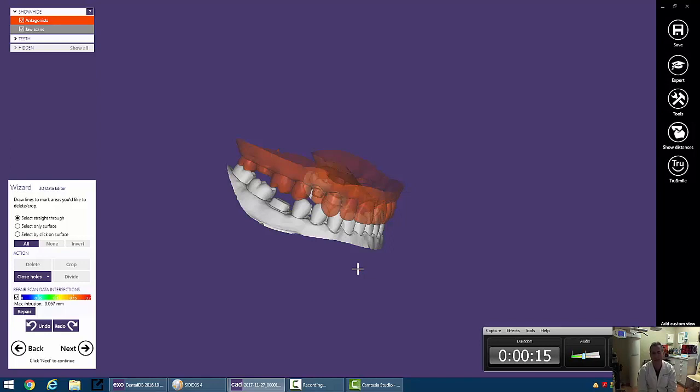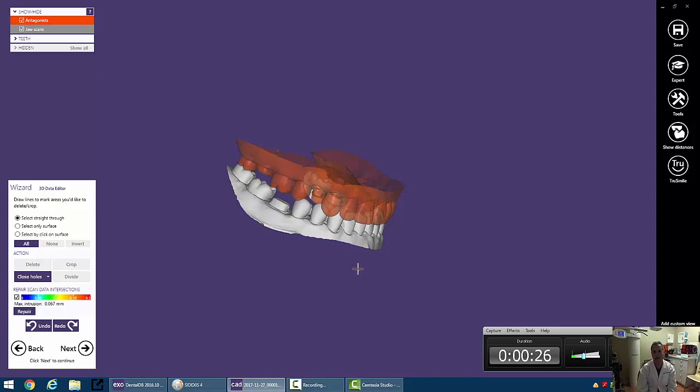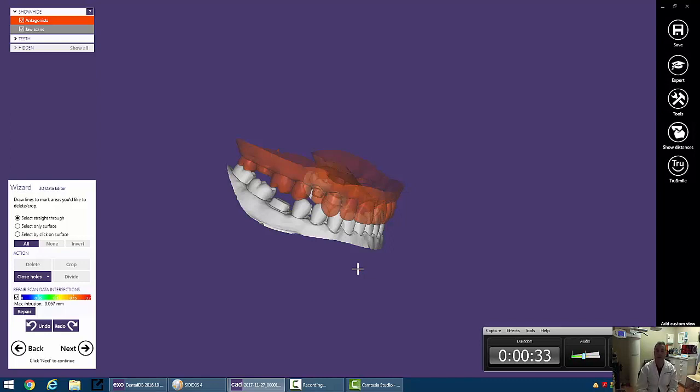Basically, this is the part where we can cut away stuff on our model. So every now and then, when you're scanning in the mouth, you may capture a cotton roll. You might capture the tongue or part of the buccal vestibule. And that may affect how you can come out with a 3D model. Now, ExoCAD does a really nice job of trimming that stuff away.